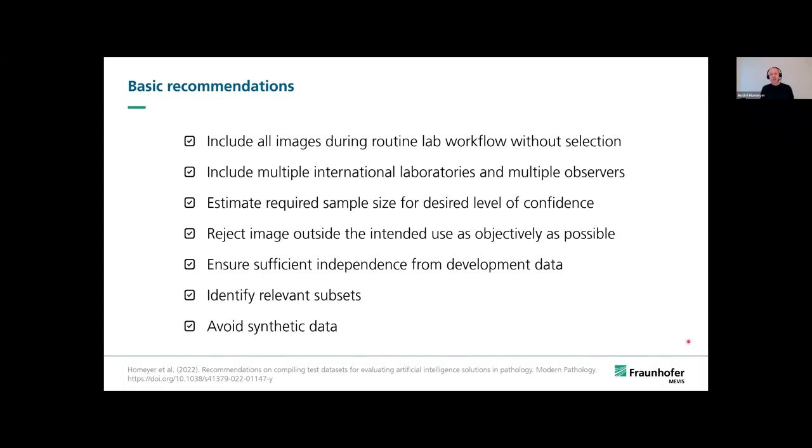In recent years, it has become common to augment training data sets for AI methods using synthetically generated image data, which is good and fine and very helpful. But we think that such methods are unsuitable to generate test data. Such methods always rely on some simplified model of real-world variability, and therefore are likely to introduce biases in a test data set, which make meaningful performance measurement impossible.